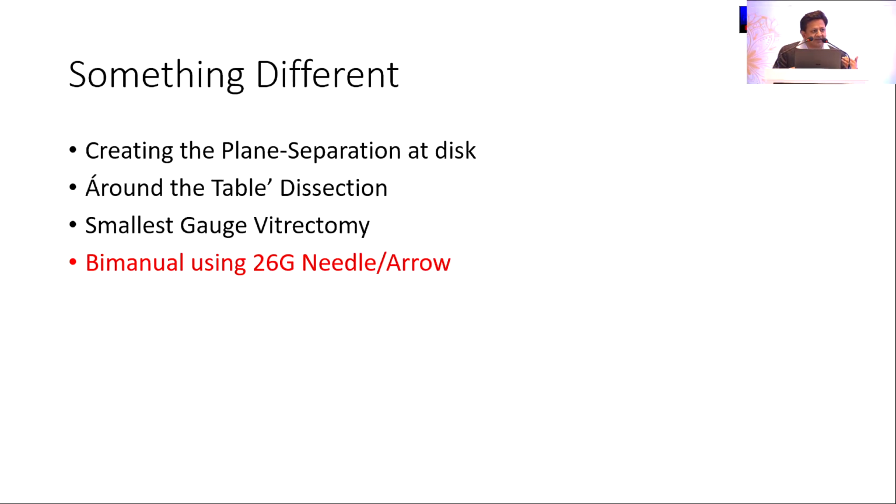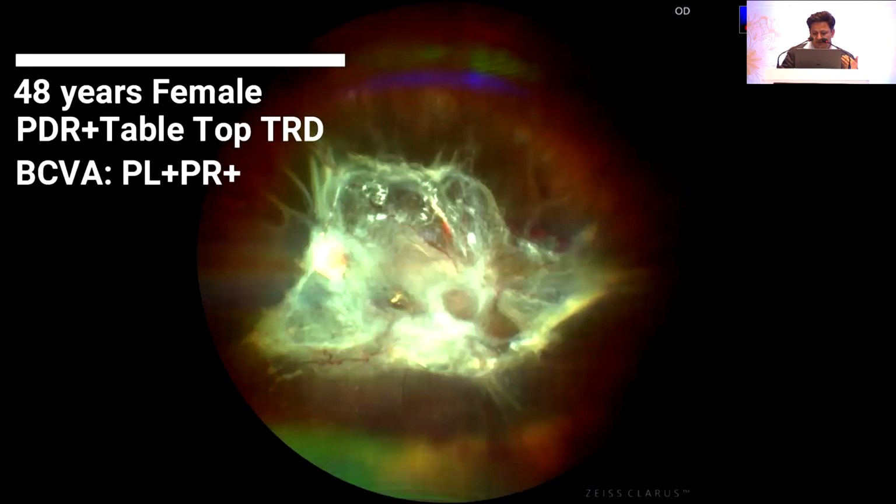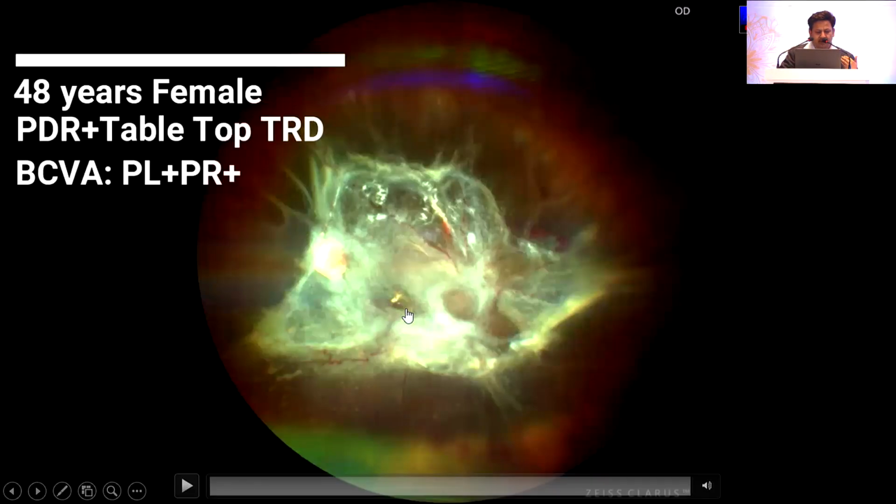Now, another thing is don't shirk to use the bimanual technique, so use it whenever it is needed. And I don't use the scissor, I generally use the needle or I use the cutter itself. I'll just show you one video of how I use the needle.